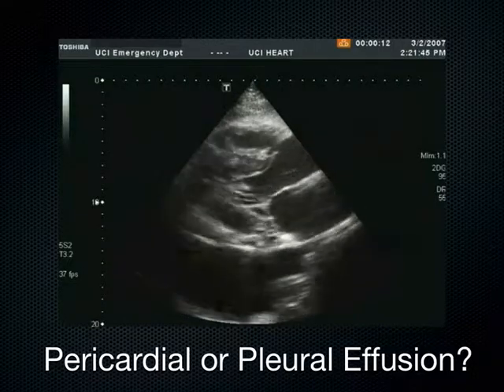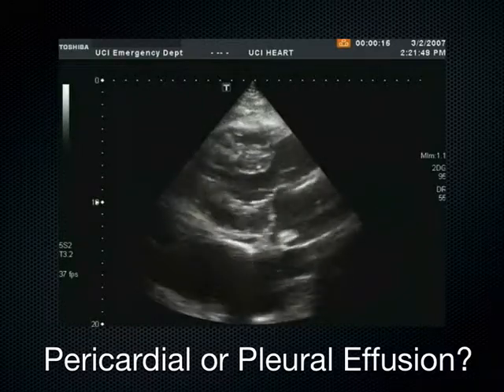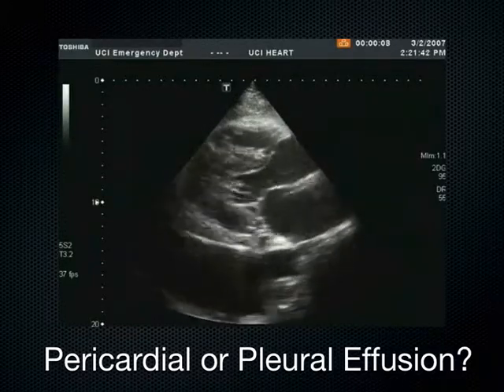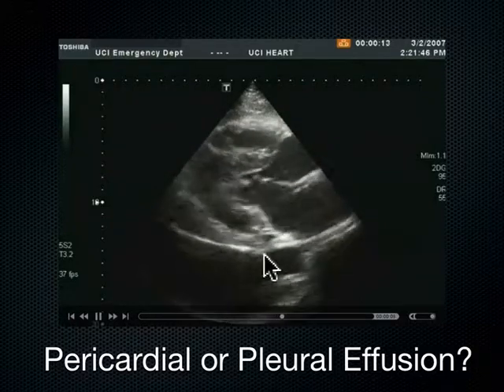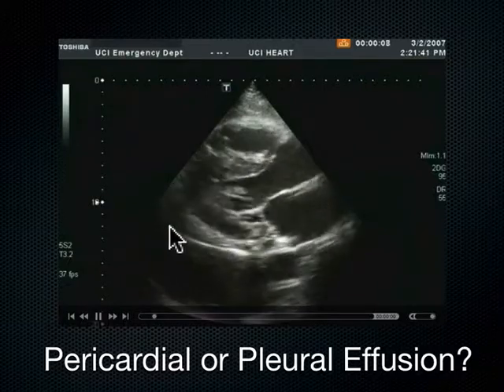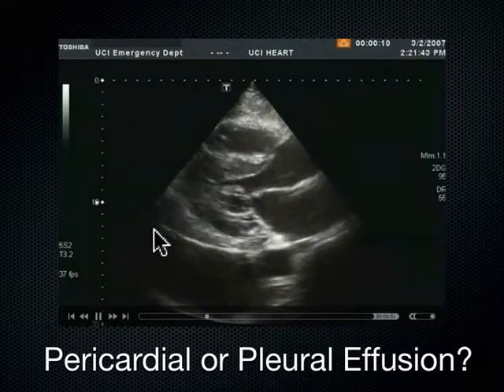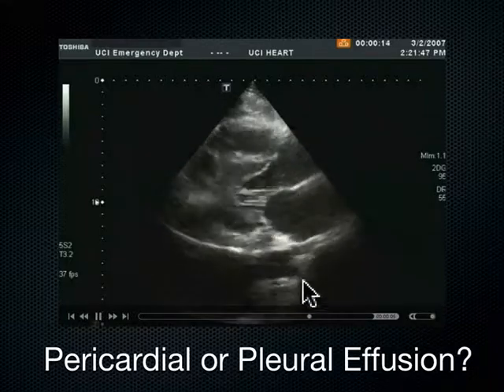Okay, last slide. Is this second to last slide? Is this pericardial or pleural effusion? This is the parasternal long axis of the heart, RV, LV, LA. Okay, the myocardium is back here. Is that also the pericardium? Is that white line the pericardium or not? The answer is yes. This is posterior to the descending aorta.